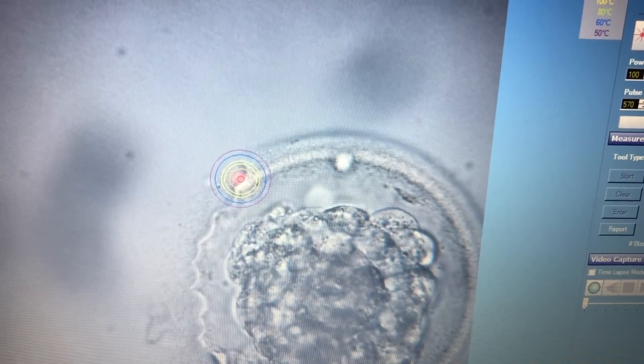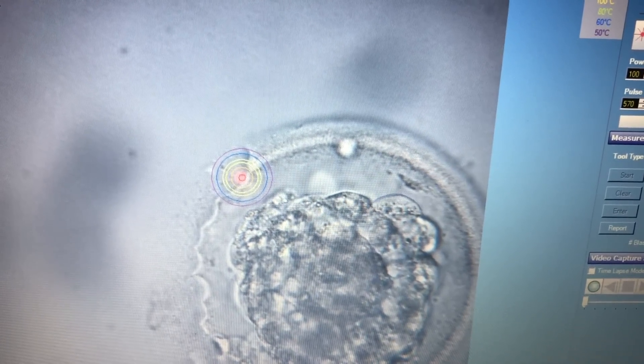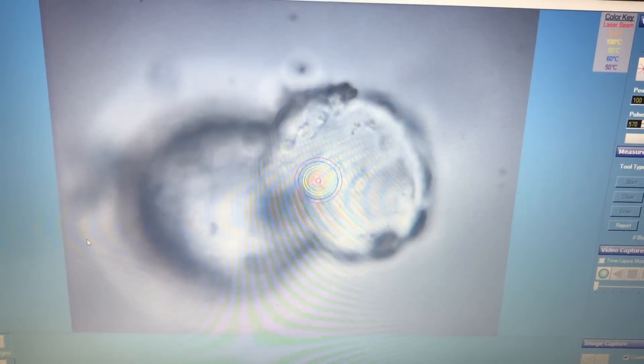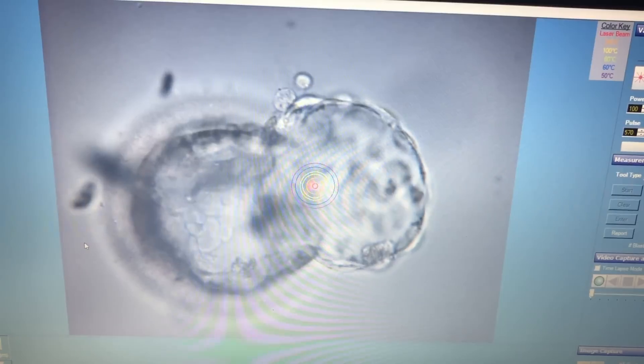Following this, the embryo is incubated for the next 4 to 6 hours prior to transfer. We will now show you the image of the same embryo, which as you can see has hatched out after 4 hours of incubation. The success rates of implantation with such embryos are much higher as against traditional blastocyst embryos.